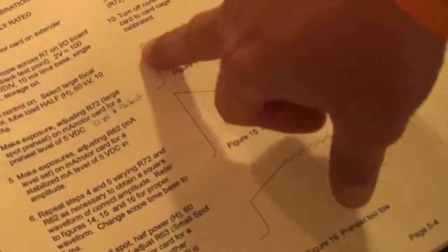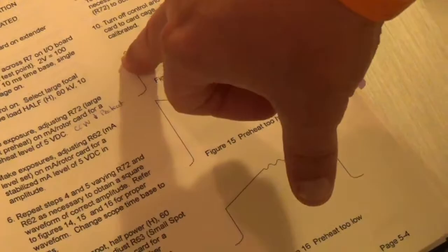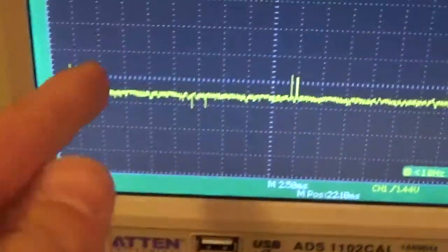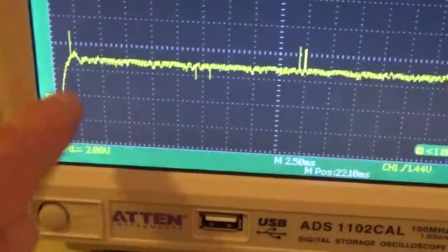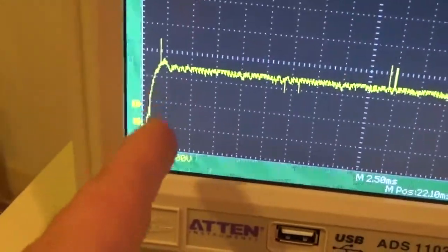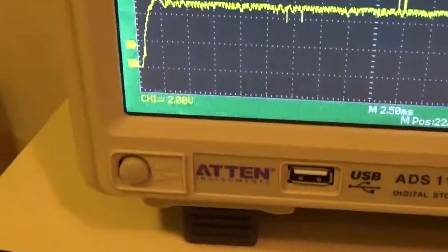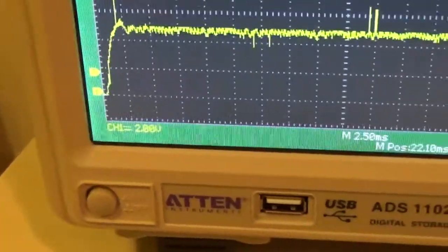They all do that. I'm looking at the proper waveform. This is over-exaggerated. So this could be leaned out? Yes, but it doesn't have to be straight. It can be lean. We're looking for when it starts here. In other words, we don't want peaks. If I took an engineering square and held it on there, it should be totally square. Or I prefer, if anything, to have it ramp up a little bit into that first pulse. That ramp-up pulse is what we care about right now.